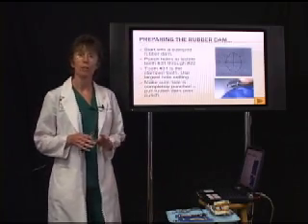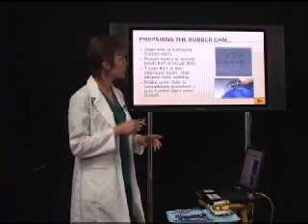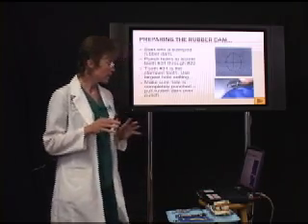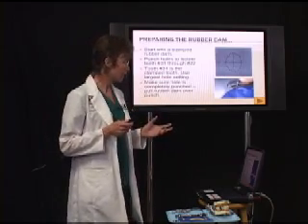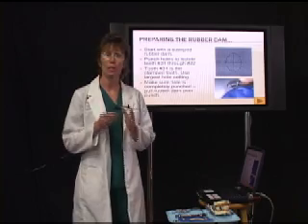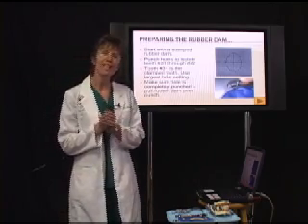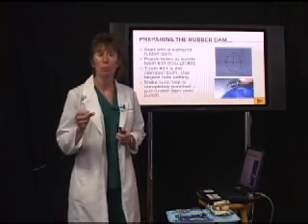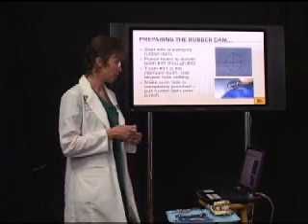First, we need to prepare the rubber dam. We start out with a stamped rubber dam — it'll have a little pattern like that. For our purposes here, we're going to isolate teeth number 31 through 22 because the tooth we're working on is tooth number 30. We always clamp the tooth just distal to the tooth we're working, so if we're working on number 30, we'll be clamping 31.